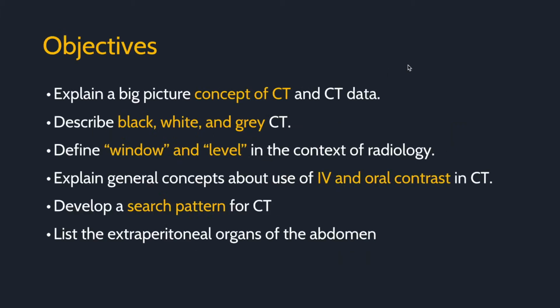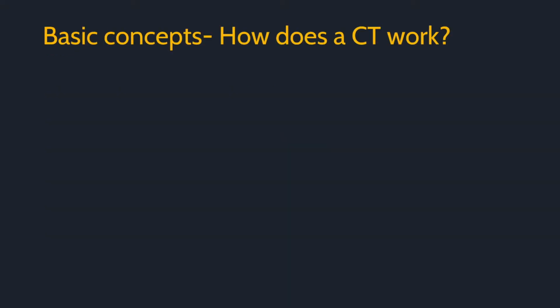By the end of this video, I'd like you to be able to explain a big picture concept of CT, use correct words to describe black, white, and gray on CT, and define window and level in the context of radiology. In addition, I want you to understand the basics of when to use IV and oral contrast. Pause the video and try to explain how a CT works as if you were talking to a medical student.